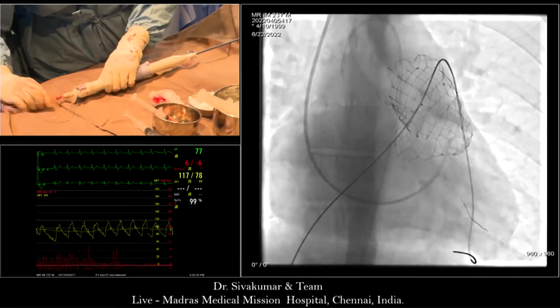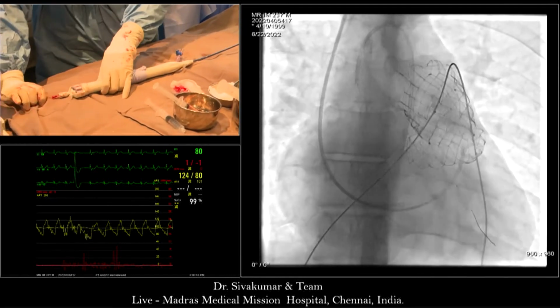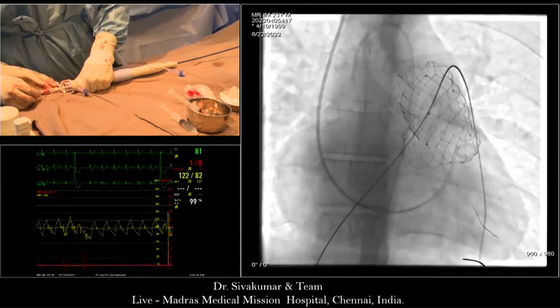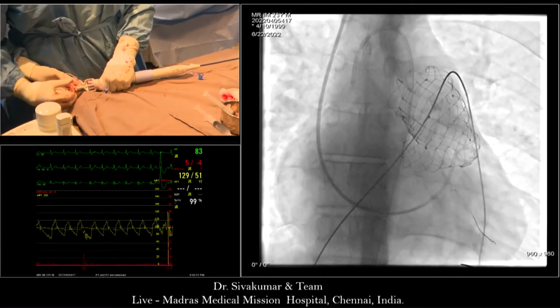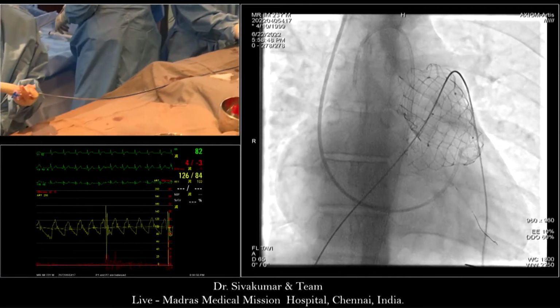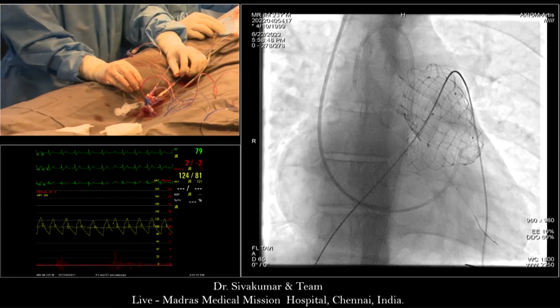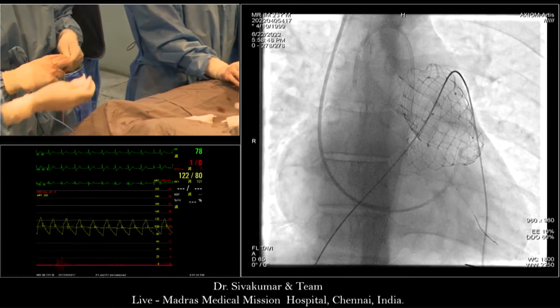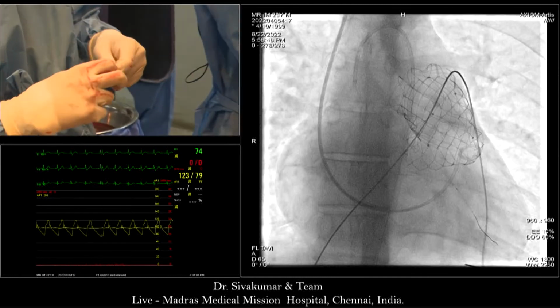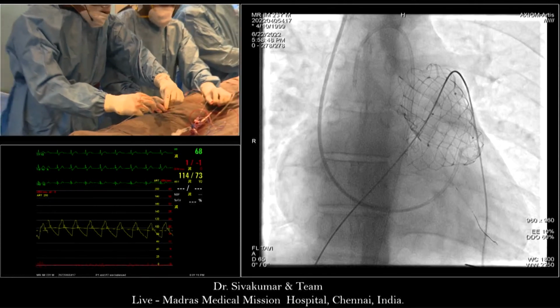Keep continuing. So just on that distal flare and the carrot, it's counterintuitive, but if you pull the wire, it drops it down away from the distal flare, and then the carrot comes out easily. Yeah, I think this is a very important point of the procedure, because when you deploy the entire valve in a good position, you can think and say to yourself, well, that's good. But pull everything back to the right ventricle if you're not careful.